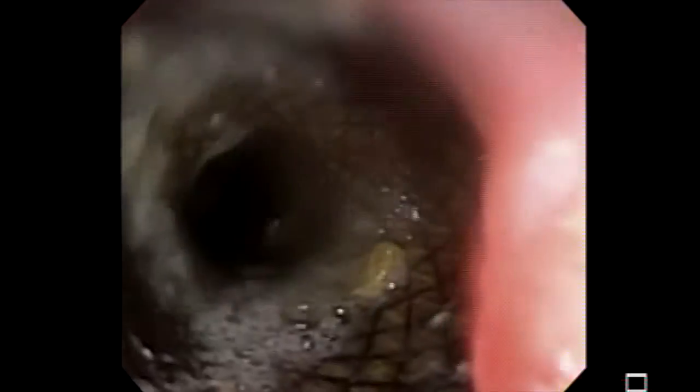In this case, we have a patient who has esophageal pleural fistula due to lung cancer, and it was covered with an esophageal stent. He's doing very well, but recently he started to have increased cough. We noticed that his stent migrated down, so the plan is to try to move the stent up and fix it with a suture.